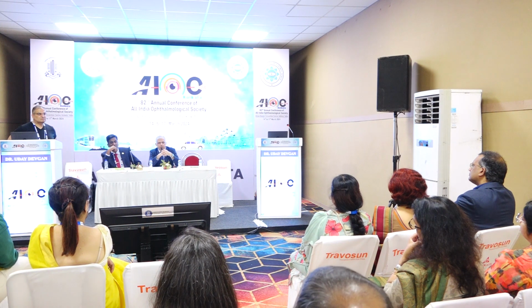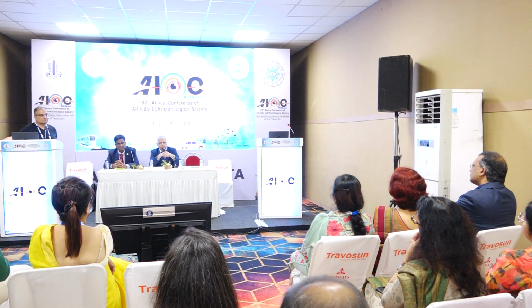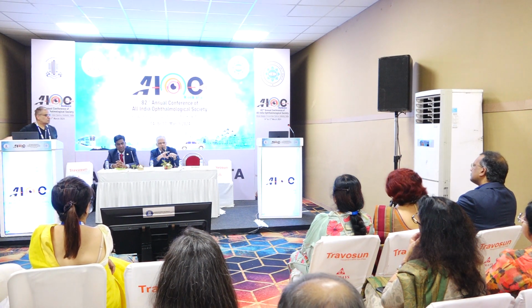Another big issue here is the extremes of eyes, high hyperope and high myope both. The second is post-refractive surgery patients. They are also on the rise. Post-macular pathology patients too. In all these, you will not have a substantial degree of precision when you calculate with your standard biometries. Now companies like Zeiss, Biotech and others are coming with their own standardized formulas. But that again opens up a huge block, because you will have to use customized lenses either made by them or their preferred lenses, which we don't want. So here comes the usage of this kind of open platform, where you have data available for all the possible intraocular lenses and the choice remains yours.